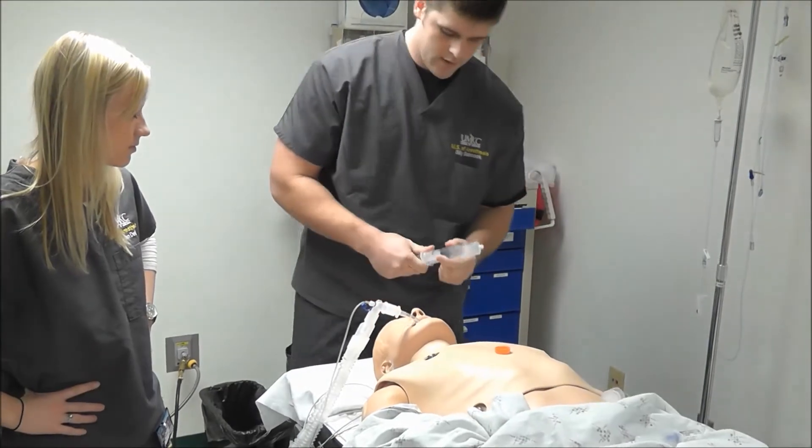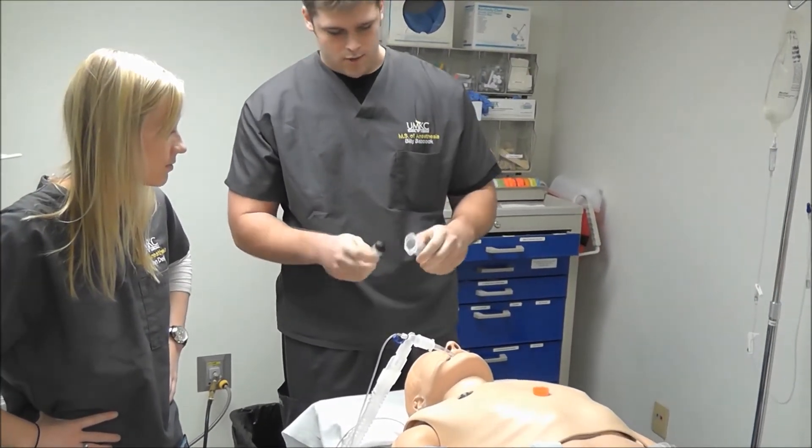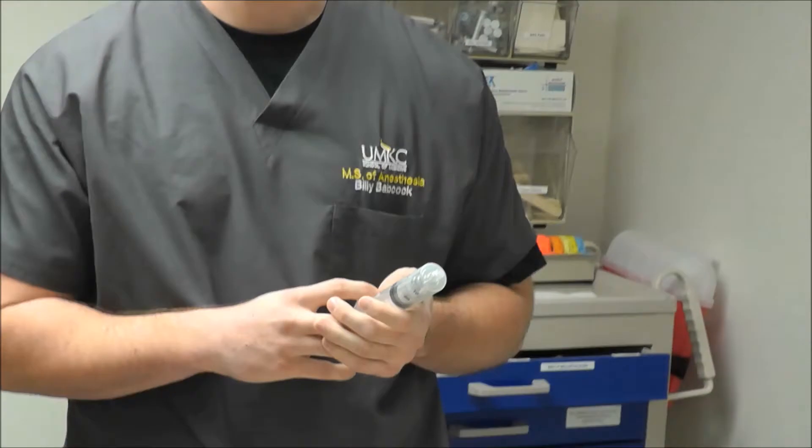So we use a 60cc syringe, remove the plunger, put the canister in the syringe, and add the plunger back. You can see that if we squeeze it, now it comes out.